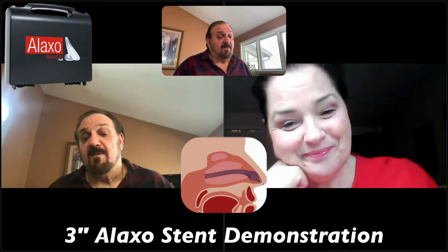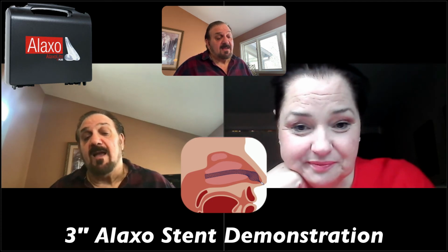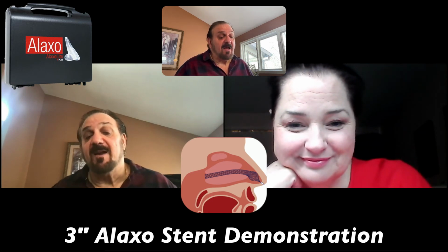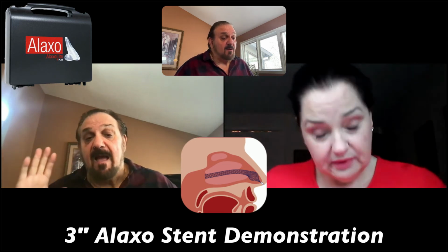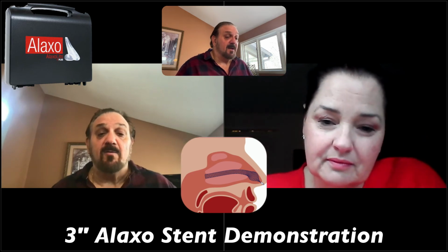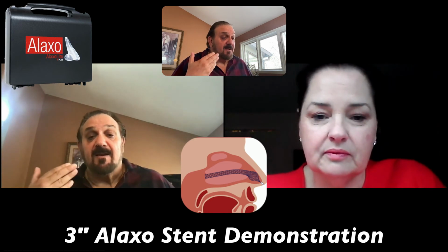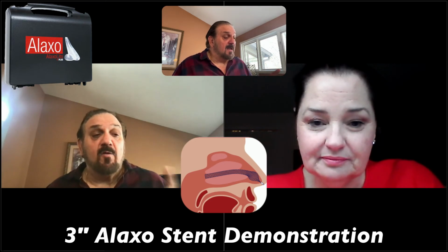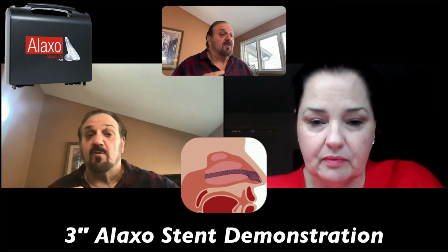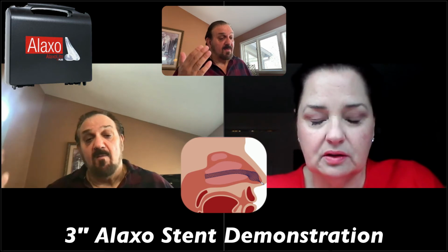No. Okay. But I do want to insert the long one. I don't need this experience on the other side right now. I've done this. I feel confident that I can tell somebody what to expect and what this is about, and that yes, there's going to be that initial discomfort. But of course, the apprehension is much less now that I've done this, thinking about the other one. But the other one goes right back to behind the soft palate, so I'm really curious to see what that feels like.